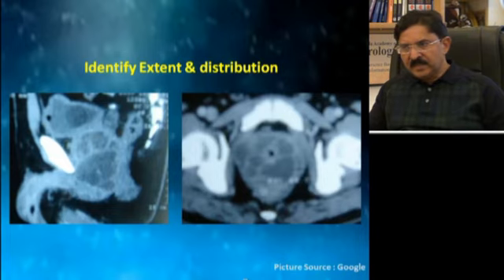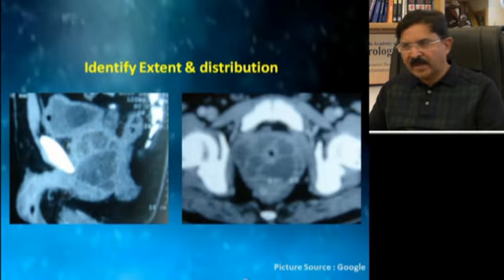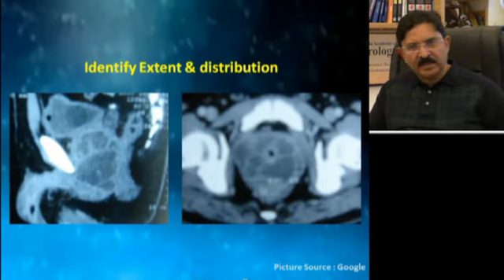In another patient, you see the entire prostate is almost replaced by abscess. A lot of cavity in the para-veru part and a smaller cavity below the bladder neck. And in another image, you can see that all around the urethral lumen there are multiple abscess cavities. So you know that you will find abscess everywhere.